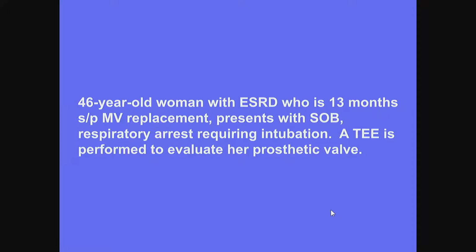This next patient is a 46-year-old woman with end-stage renal disease who is 13 months status post mitral valve replacement. She presents with shortness of breath and respiratory arrest requiring intubation. A TEE is performed to evaluate her prosthetic mitral valve.